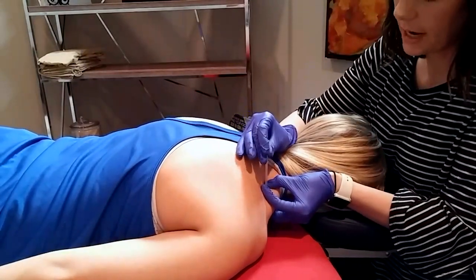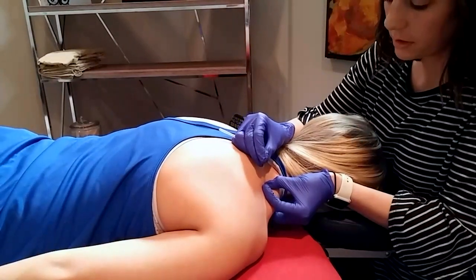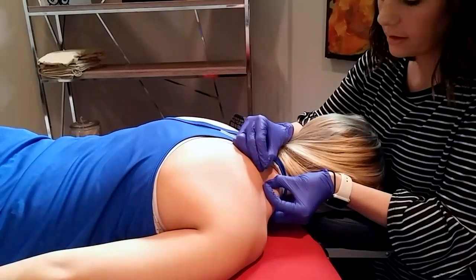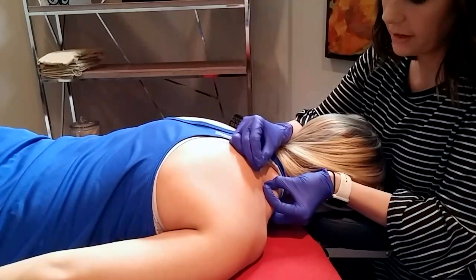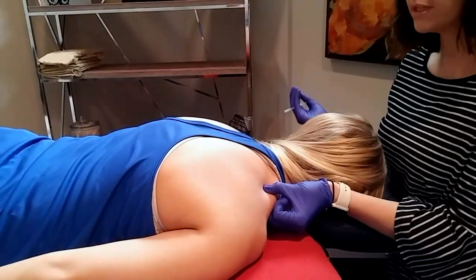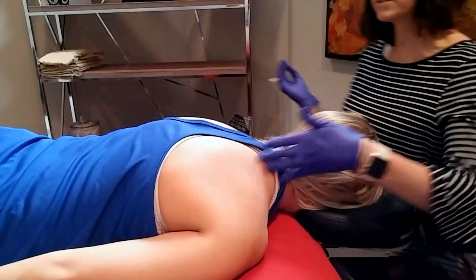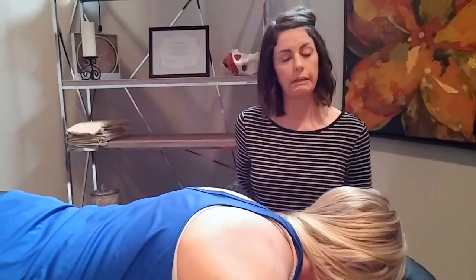So then I'm just going to tap the needle into those tissues and go straight into that spot. And I don't know if you can see or not, but that muscle is just jumping a little bit. And we just kind of fan that needle. Perfect. And then we take it away. And most of the time there's no blood. Every once in a while there's a little bit. You doing okay? Yeah. Okay. And so that's what we're looking at whenever we look at what we do for dry needling.